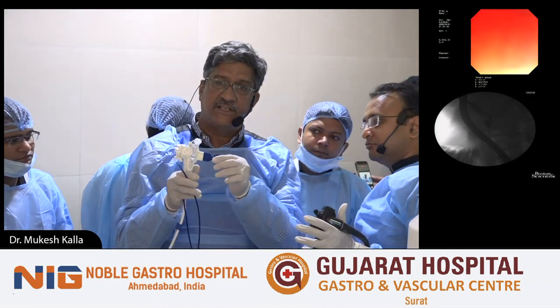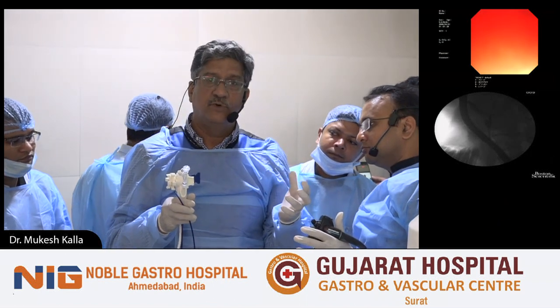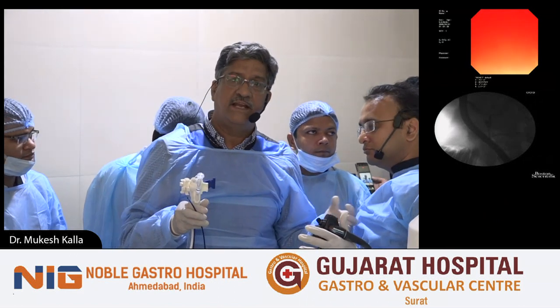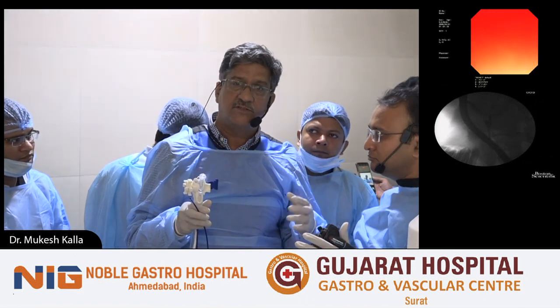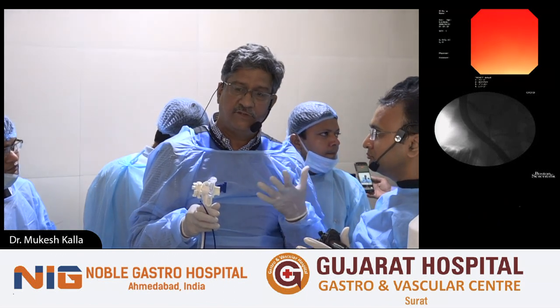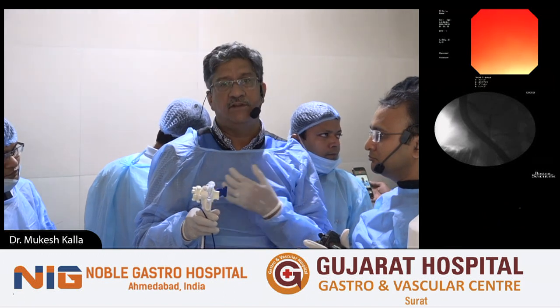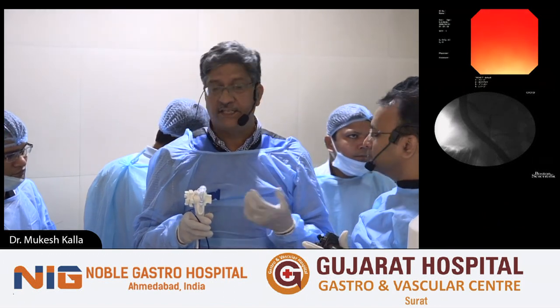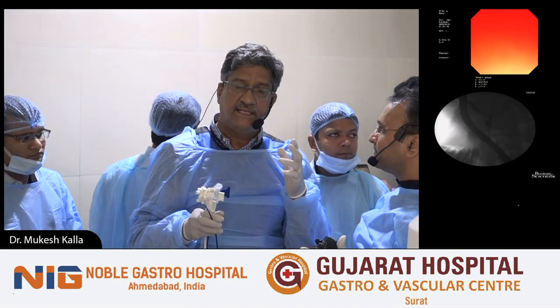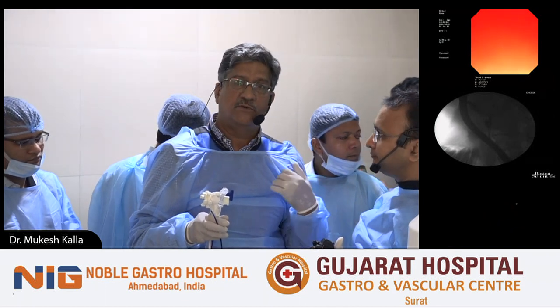Using this, we can fix it on the handle of our ERCP scope, and we can use both things. But unlike the West, here, me and Somil, we are happy doing this procedure together, where there's no financial burden on it. So I normally prefer in my unit that we two people work together. Either it can be my fellow gastroenterologist or a well-trained technician is also of great help. So let us first go inside, visualize the stone, and when the need comes for laser lithotripsy, we will talk about that as well.